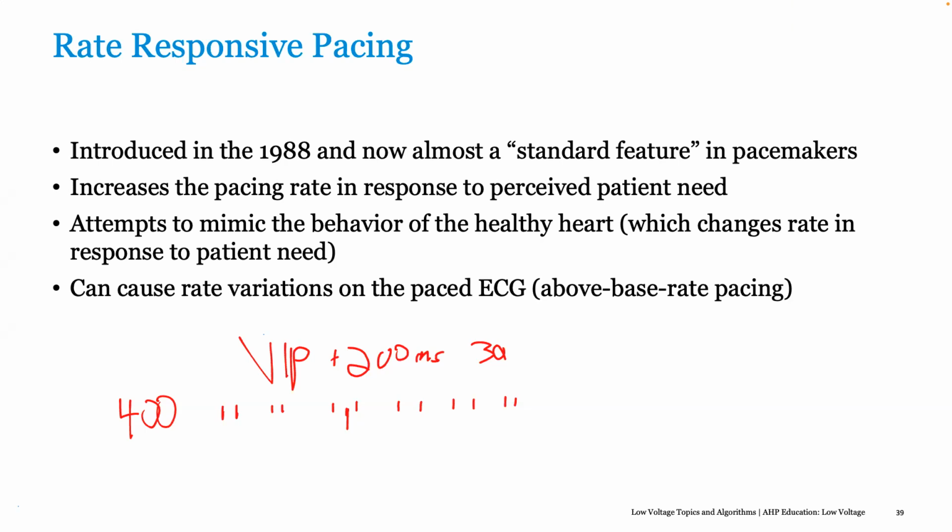And with Sentia and Sphera, we don't have many of the software advantages that you have in Azure and Adapta and other new devices. It is the opening up for Pace for Life and the trial that is going on that is giving us the advantage of having all this.